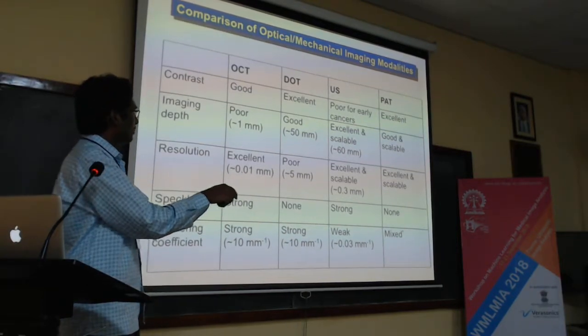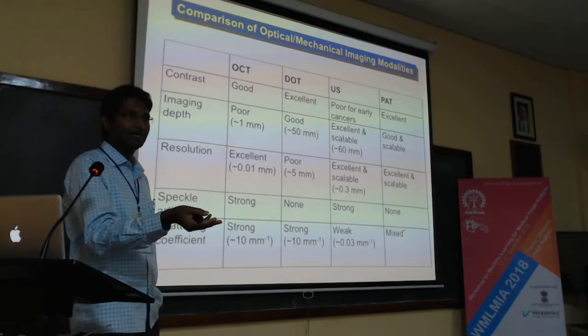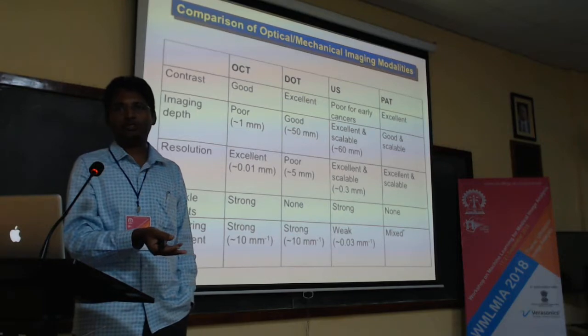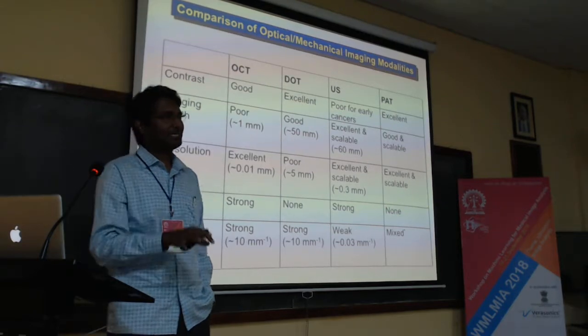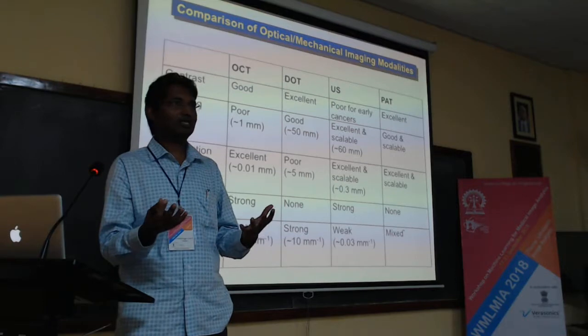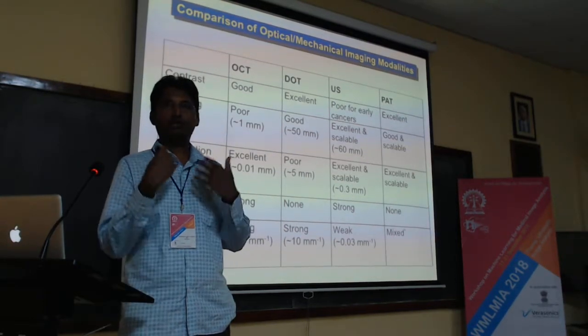So when we talk about photoacoustic imaging, what we are talking about is just removing that sending part. We are going to irradiate with a laser, and all we are trying to do is detect with the ultrasound detectors. So purely from the detection point of view, ideally, if you are buying an acoustic detector for the photoacoustic system, you need not have the generation part. You just need detection.